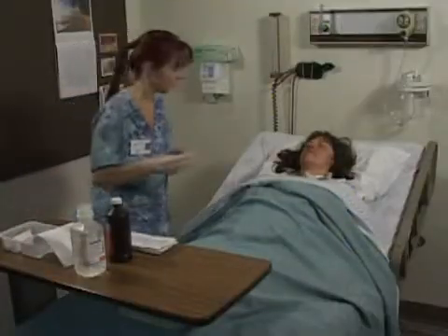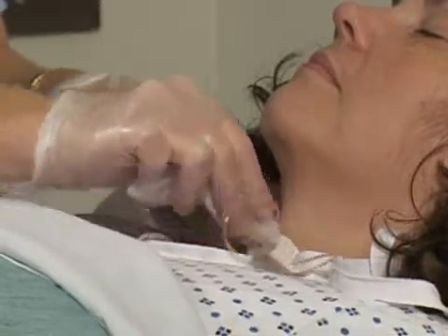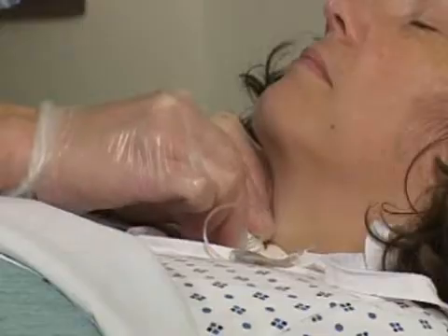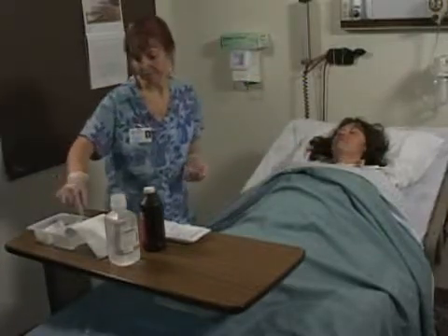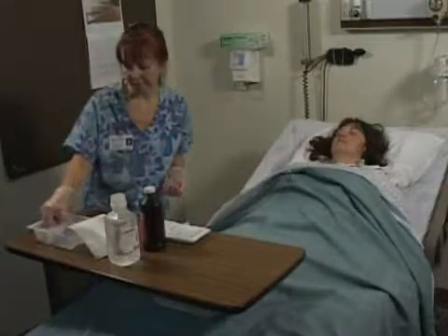Repeat the same cleansing procedure under the neck plate on the skin of the client. Be sure to use cotton applicators to dry the skin under the neck plate to prevent skin irritation or breakdown. If the tracheostomy tube has an inner cannula, the sterile cleaning of it can begin now. Remove the inner cannula from the outer cannula and place it in a solution of hydrogen peroxide and sterile saline to soak. Nurses differ on whether they do this before or after the cleaning of the neck plate. The soak should not take but a few seconds, so either timing is good for the client.